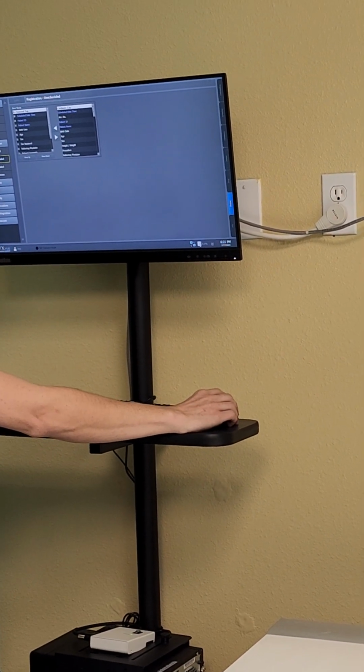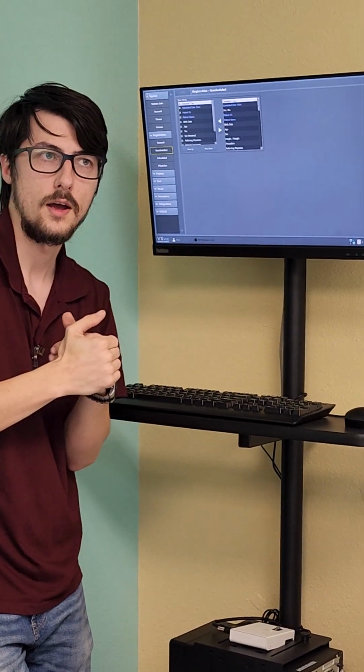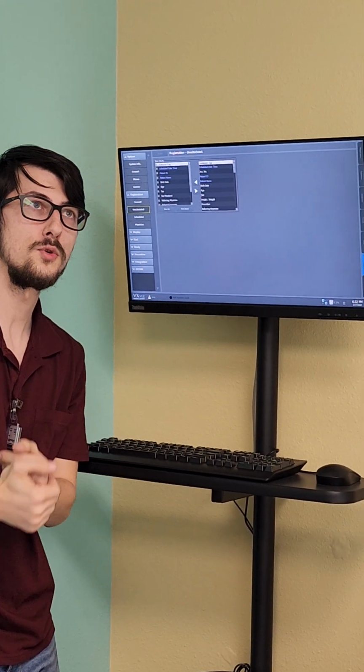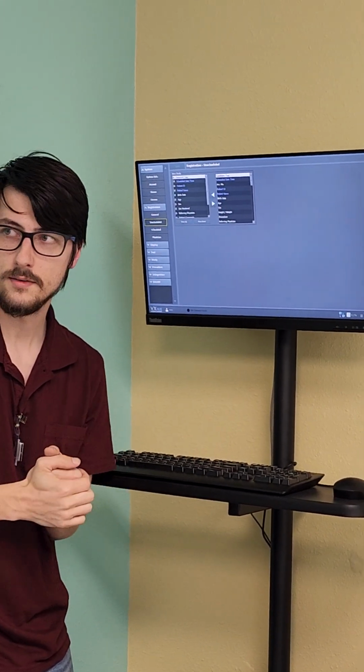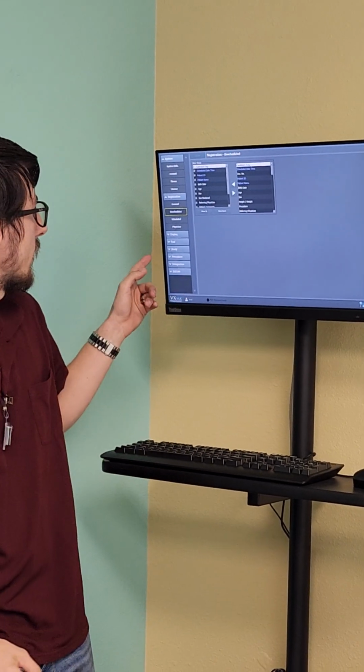This over here is your hard drive space. So if you take more and more images, it's going to start filling up. If it starts getting too full, you'll notice your computer start to slow down a bit. What you can do is buy a flash drive or a hard drive, plug it in, and then hit archive images from the settings in here.